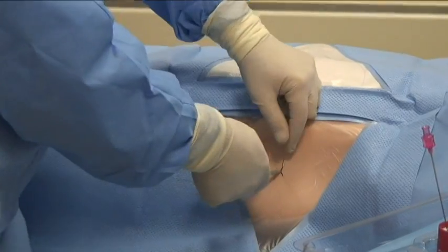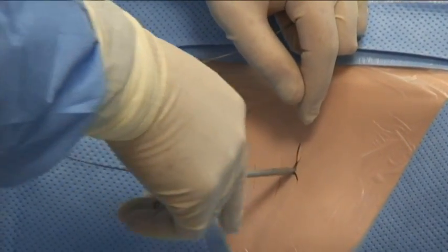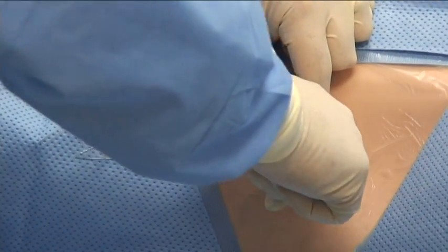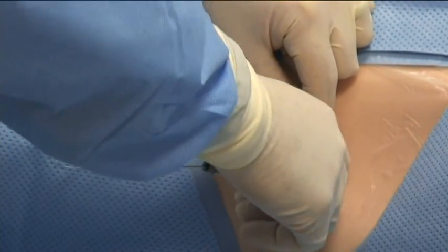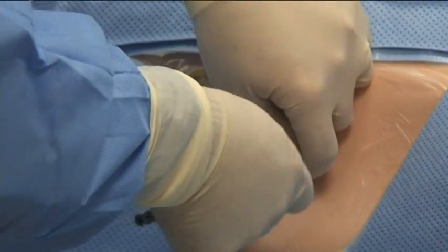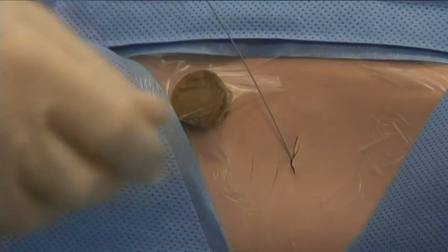And as I push in through, it's important to hold the dilator from the front tip. The back tip doesn't give you any leverage. If you hold it from the front tip, and with a twisting and forceful motion, you'll feel a slight give just as it goes into the chest space. And that's a very good sign that you're in. So at this point, you can now remove the dilator, and again, carefully put it down.